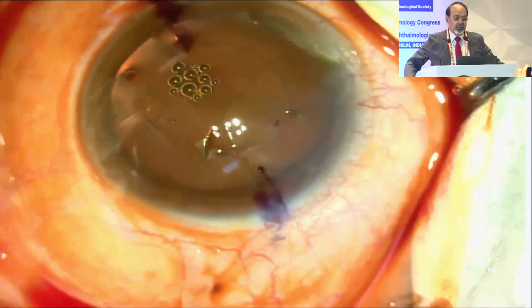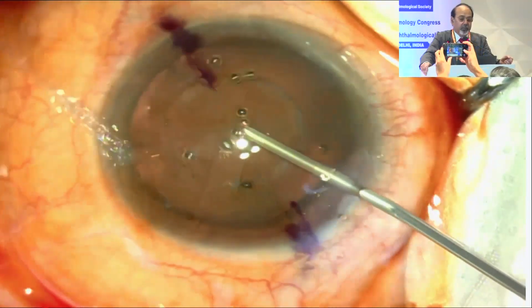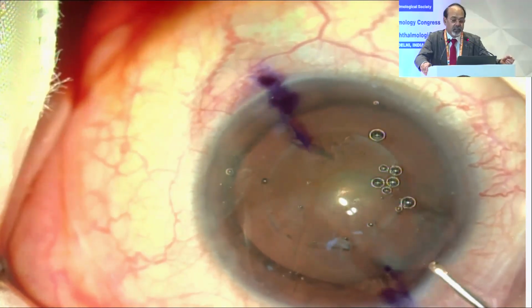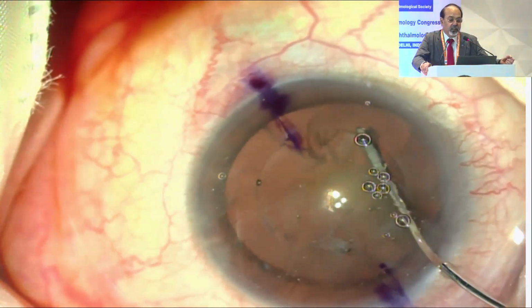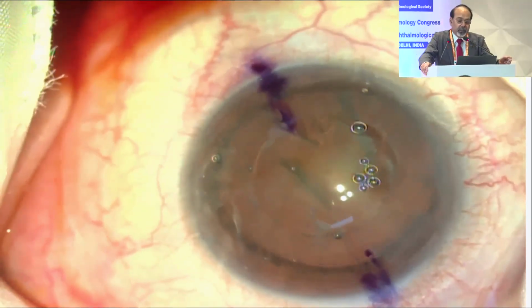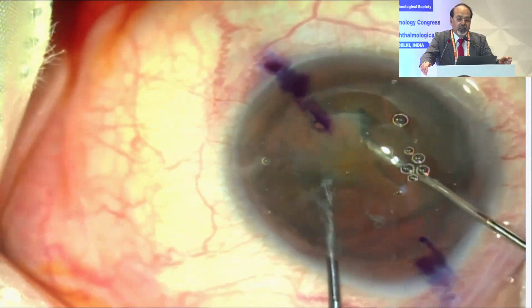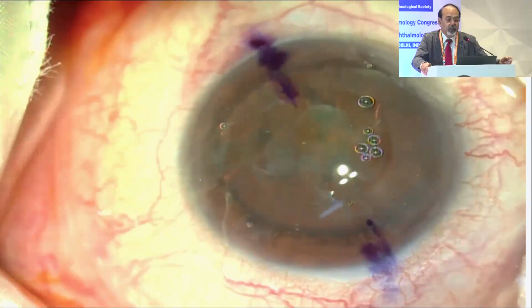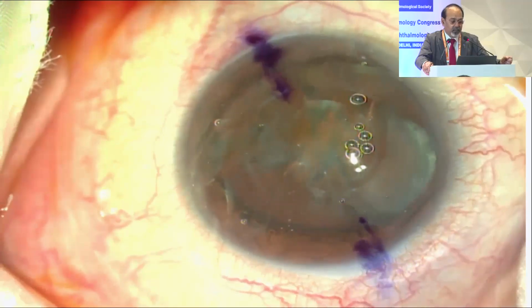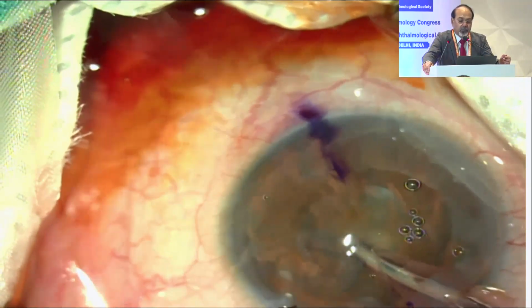You can see that the incision is opened. There is astigmatism in this particular case. So I am going to put a toric Tecnis IOL, because the Tecnis is the best, as already discussed earlier in the question answer. And you can see that there is a very nice capsulotomy done by the laser, and the incisions, the cuts which are there because of the RK, do not hamper the effect of the femtolaser in reaching the lens, so there is no defect in the capsulotomy, and there is no need to pull the capsulotomy out.